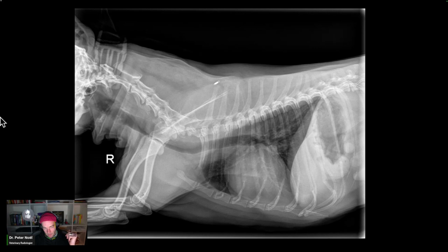So I think one of the things I just wanted to put to you is the term that I will sometimes use, if I think it's tracheal collapse, like your brachycephalic dog and this thing is smashed shut. You can say tracheal collapse, and then you say it's probably from chondromalacia. What could be less specific but potentially more helpful ultimately is to use the terminology dorsal tracheal opacification. And that dorsal tracheal opacification right here, its presence is dependent upon several factors.